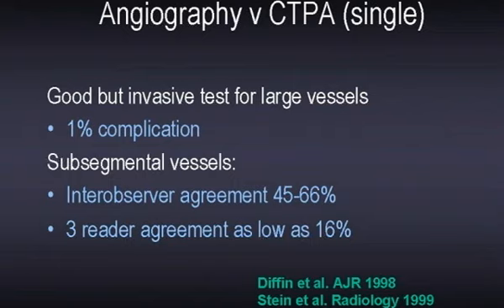And if you're fortunate or unfortunate enough to have three angiographers in your practice, well, the agreement between these people is as good as three people trying to guess what a coin flip is. It really is extremely low at 16%.